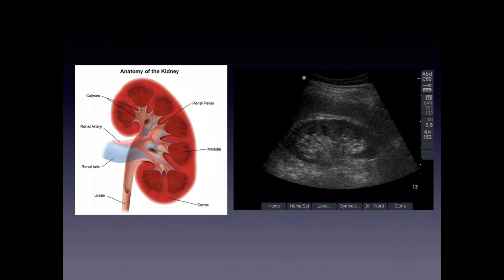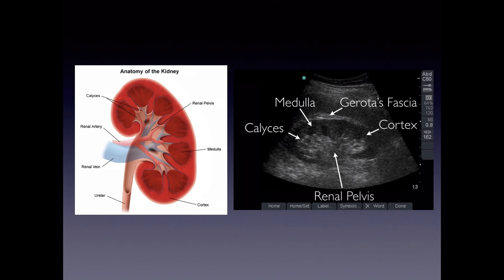The exterior part has Gerota's fascia and perinephric fat, which is going to be hyperechoic. The renal pelvis is also hyperechoic, and the renal sinus is where you would see dilation if there was hydronephrosis — that would appear anechoic within that hyperechoic area. The medulla is more hypoechoic relative to the cortex, and then the calyces drain into the renal pelvis.